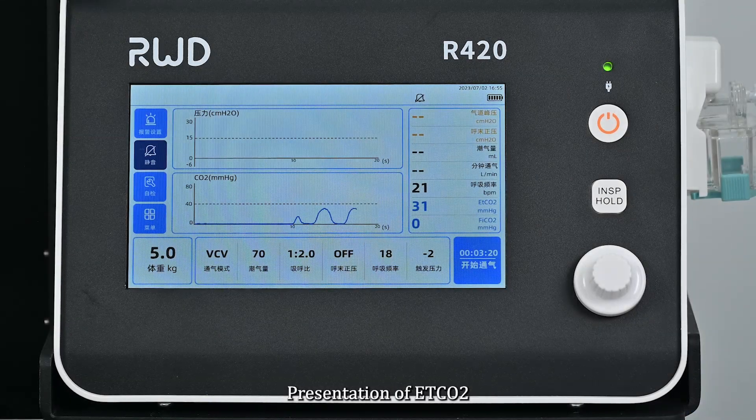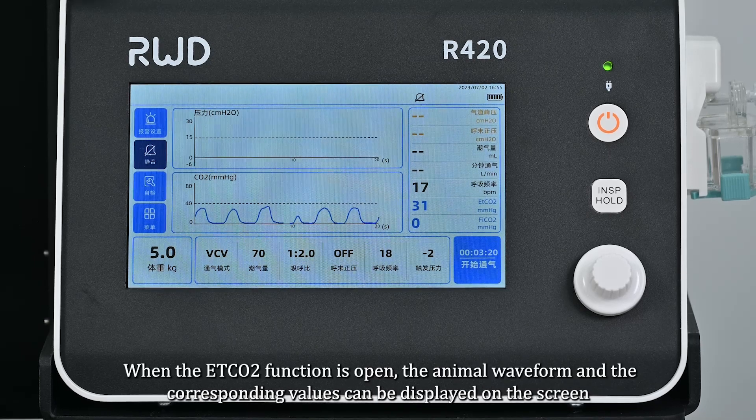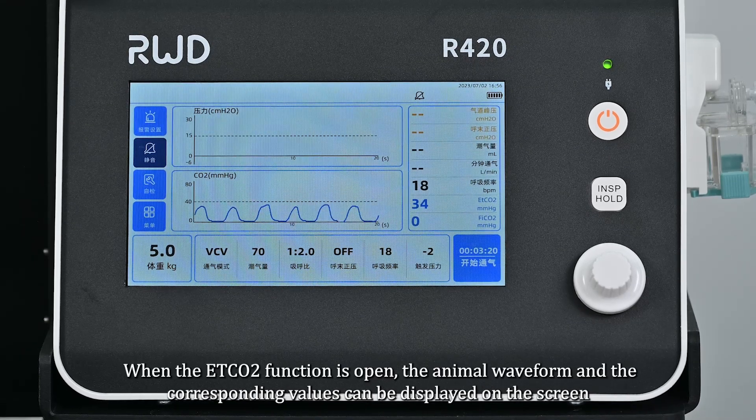For ETCO2 presentation: connect the sampling tube to the interface. When the ETCO2 function is active, the animal waveform and the corresponding values can be displayed on the screen.